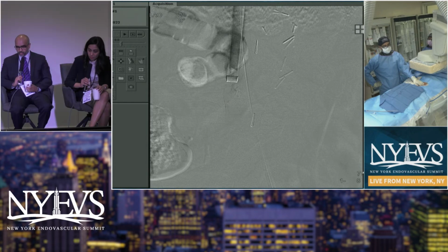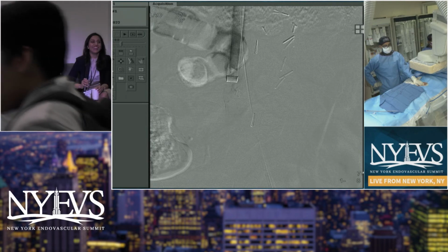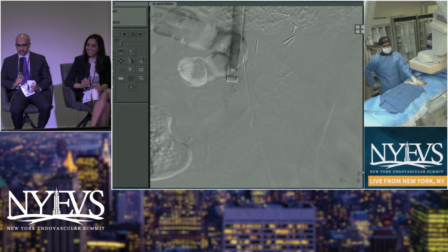So in Michigan, we take out a lot of Greenfield filters, since they were created there. We take out many of them that have been in for years and years. And what we generally do, if we're worried about something, which in general we kind of are when we're taking out a Greenfield, is use IVUS. I find IVUS actually shows you the rent in the cava much better, because it might be posterior, you're not seeing it well, there's double density. So we do IVUS and you can see it, and then you can deal with it that way.